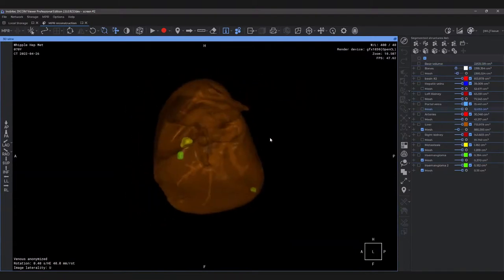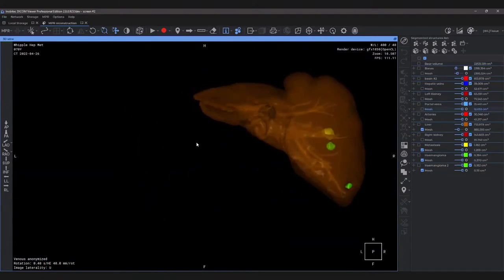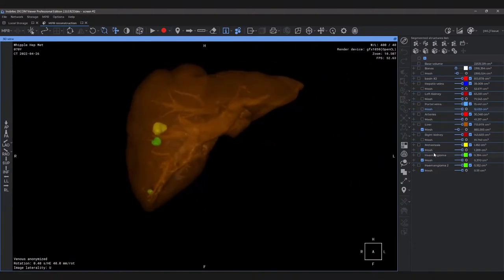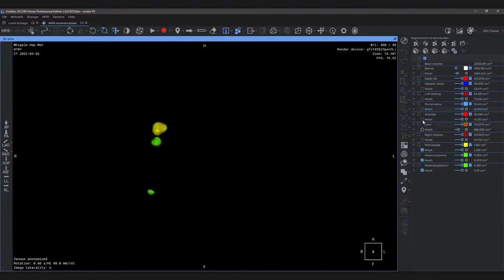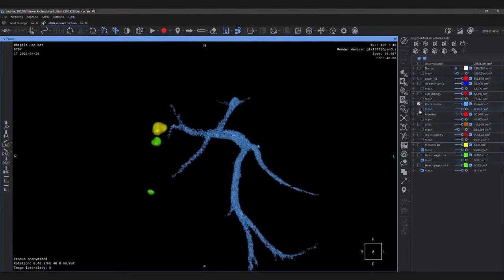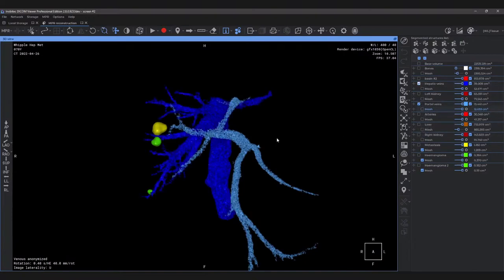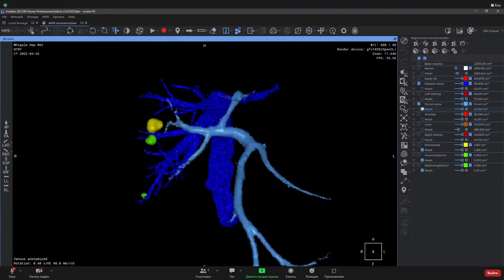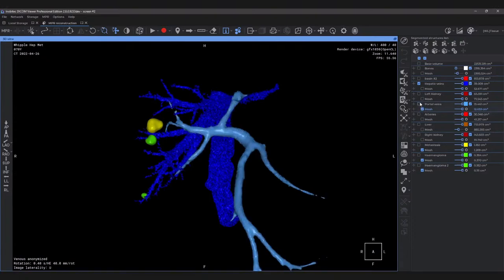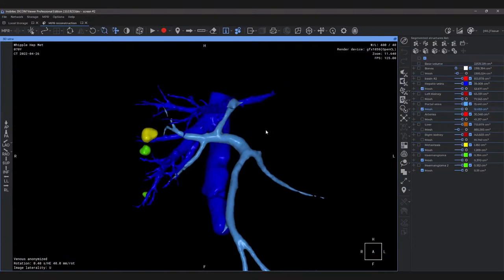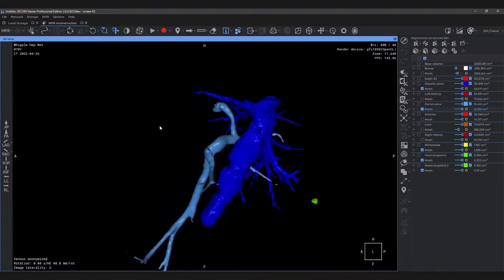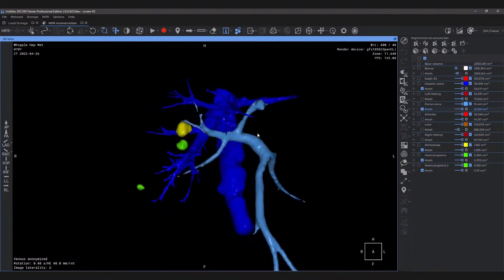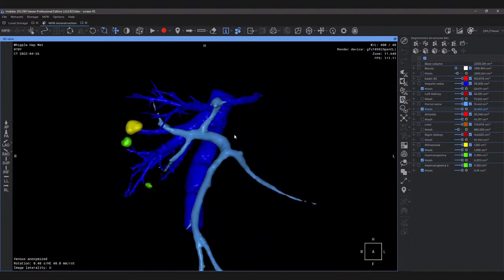What I'm going to do now is I'm going to open a CT study of a small tumor of the left hepatic bile duct and I'm going to fuse it with the MRCP in order to show the blood vessels and bile ducts and their relationship to the tumor. Let me just quickly open the MRCP. Here it is. And then I'm going to open the MPR view and then I'm going to try to open the projects that I've pre-saved.